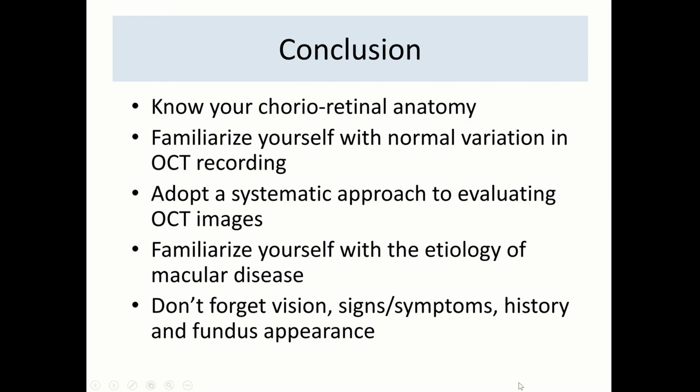So in conclusion, know your chorioretinal anatomy, familiarize yourself with normal variation in OCT recordings, adopt a systematic approach to evaluating OCT images, familiarize yourself with the etiology of macular disease, and in the end, do not forget vision, signs, symptoms, history, and fundus appearance.